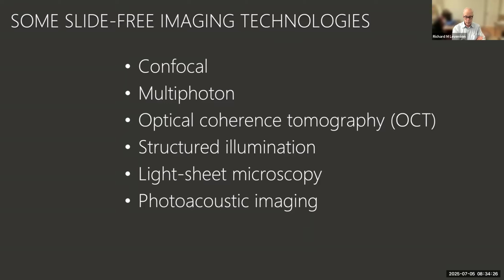So, for example, in prostate, it's apparent or believed that the shape of the prostatic glands, benign and malignant, are best appreciated in 3 dimensions, not on just thin sections. And then another very orthogonal way of doing things called photoacoustic imaging. These are all remarkable and can generate some really beautiful images, but they do have certain issues with them.